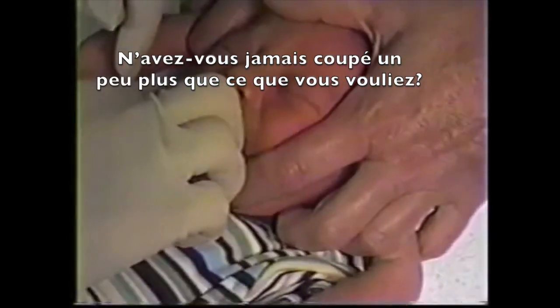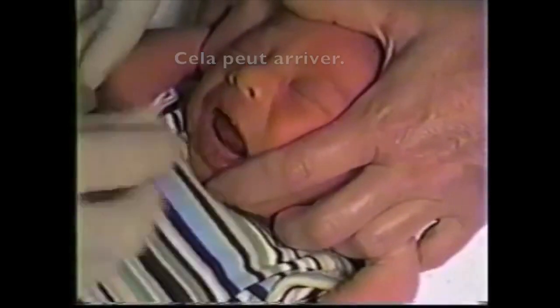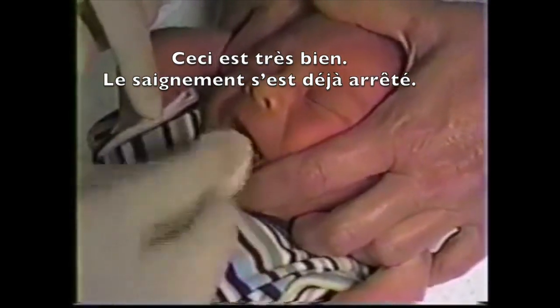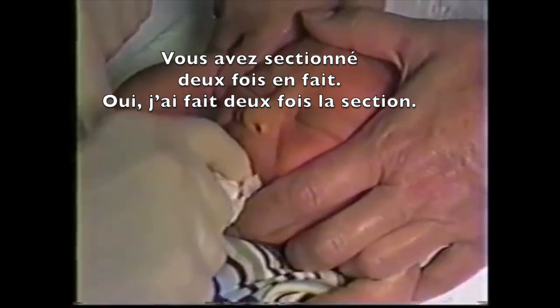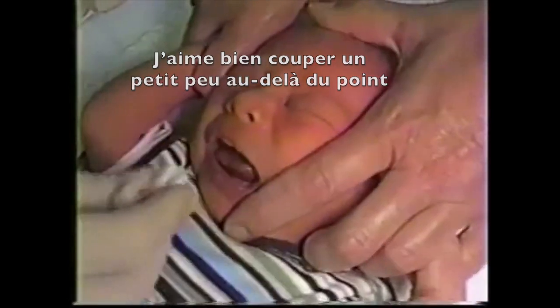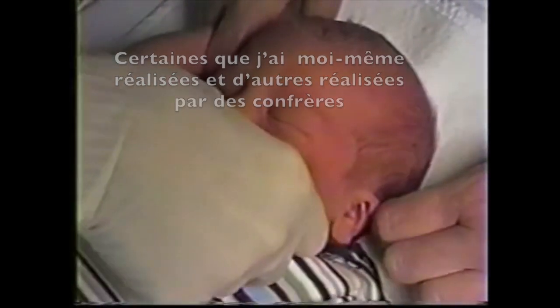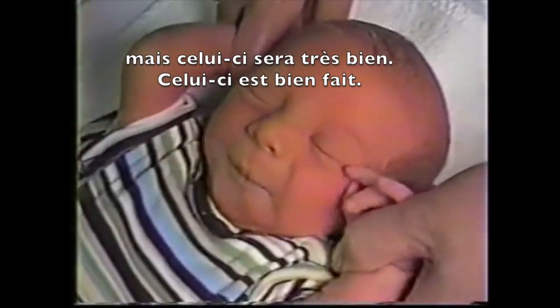Have you ever cut a little bit more posterior than you wanted to? Well, that can happen. That's why you have to be very careful not to go too deep the first time — you can always go in again. I did do two snips. Sometimes you can get by with one. I like to go a little bit beyond where the muscle protrudes, because I've had to revise some that weren't quite loose enough. But this one is good.